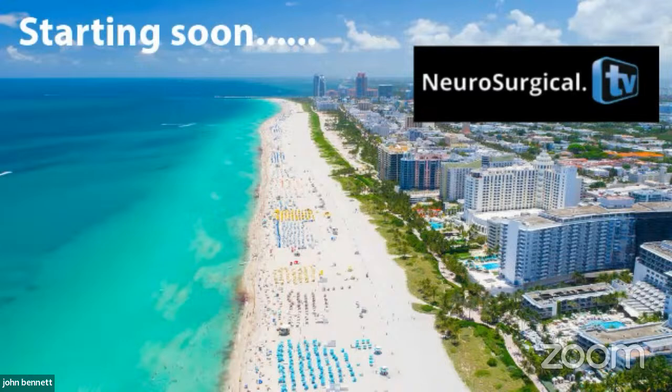Now, just to comment on vascular lesions, these approaches are great for brainstem cavernomas, especially when they present between the fifth and the seventh nerves. This patient had multiple cranial nerve palsies from multiple hemorrhages. He had a failed retrosigmoid approach by another surgeon. They also tried to do this endonasally, transclival, and he was still left with residual. There's a DVA. It's important to preserve the DVA when you're doing these approaches.